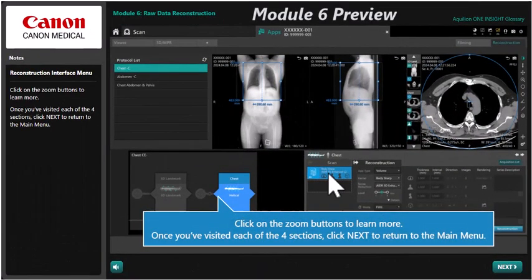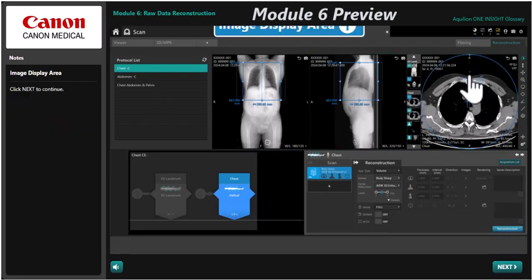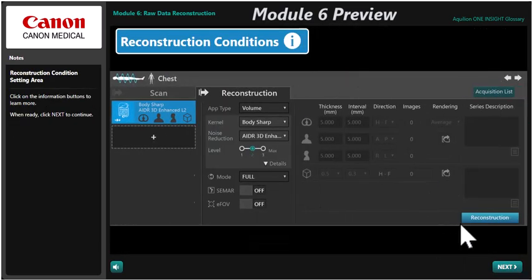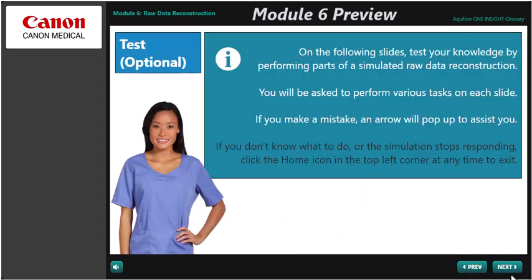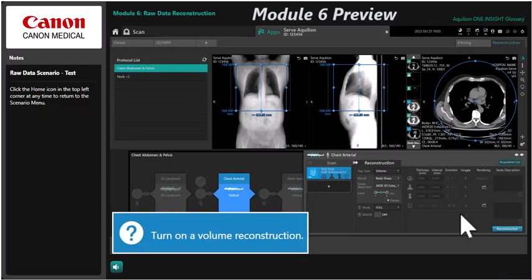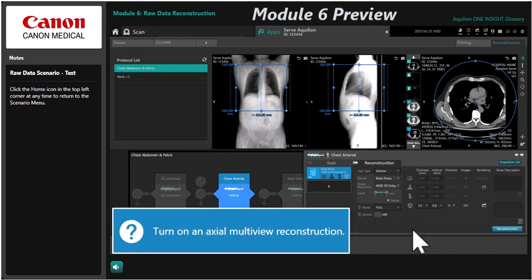Module 6 will provide a detailed explanation of how to produce additional reconstructions from raw data. Like Module 3, this module has interactive exercises that simulate the process of generating images from raw data.